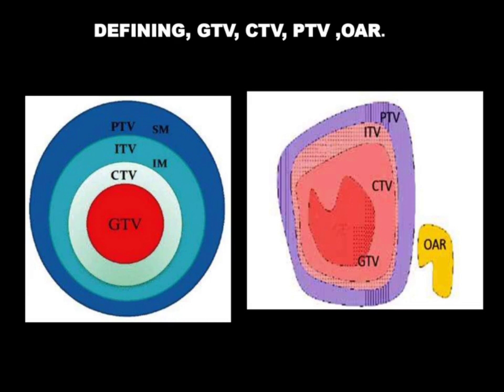So these changes in the target volume, and as well as a large volume of normal tissue, can be incorporated in the radiotherapy, which we don't want.